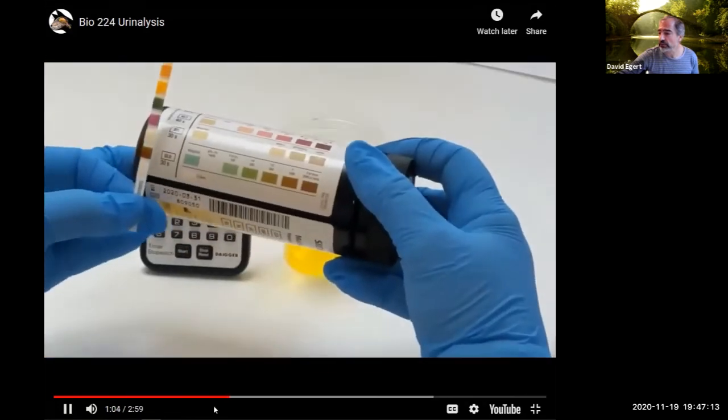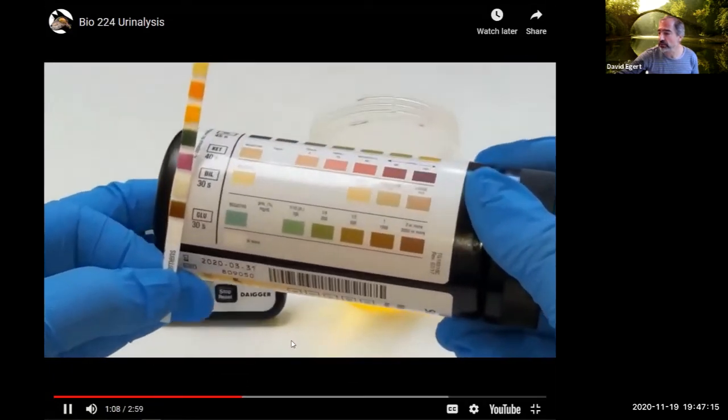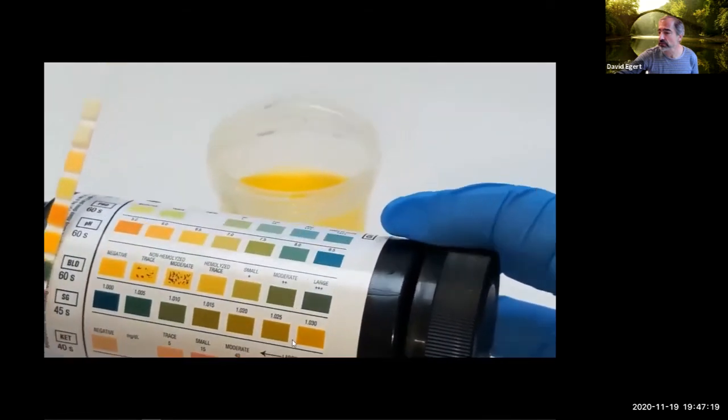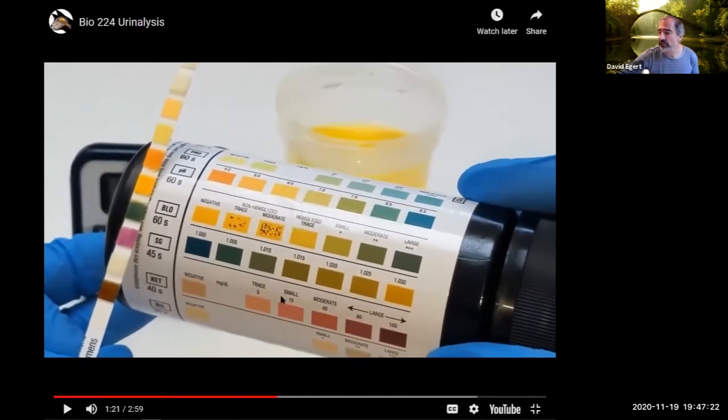Nice. Okay, 30 seconds. So we're reading the test strip. We're measuring glucose, bilirubin, ketones, specific gravity, blood. Right, so use this video of somebody actually doing it for real to record the data. This is just to give you a sense of what it really feels like to do this. And again, you can see what things look like on the strip, and you can see what things look like on the key.